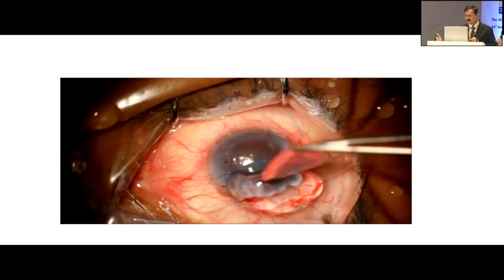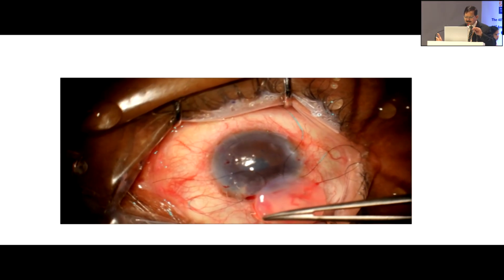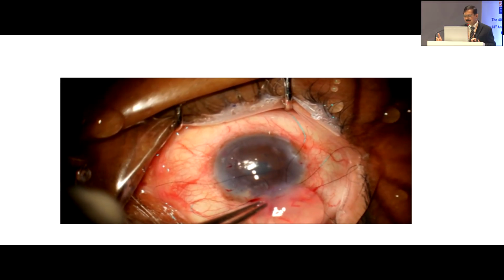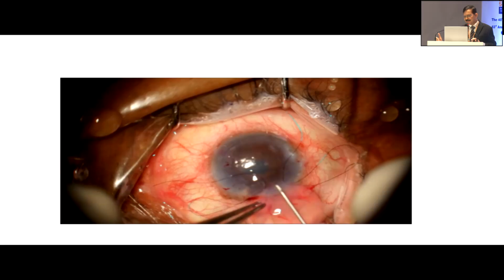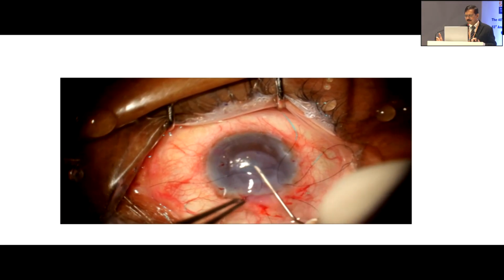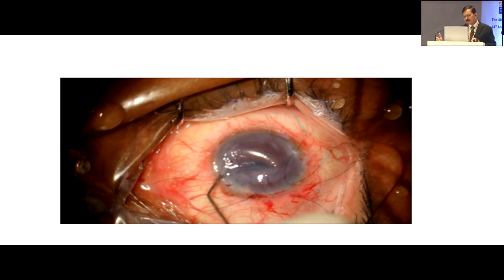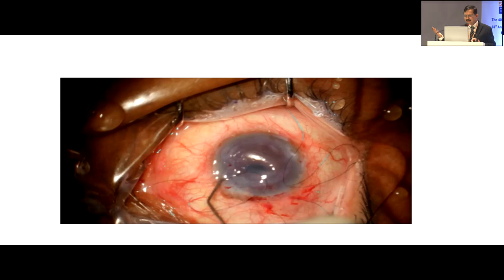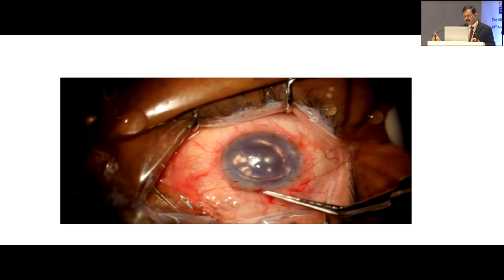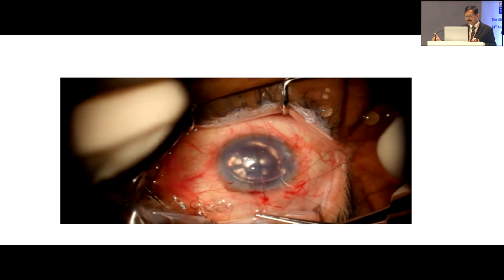This is what I used to do earlier. Now put viscoelastic, preferably a chondroitin sulfate, with the endothelium down over the tunnel, and using the same 26 gauge needle you can just push under the saline itself. Now you can see the lenticule which has gone in. Under the lenticule you push air so that it pushes the whole thing up against the corneal stroma. Now it is better to suture the wound so that air doesn't escape.